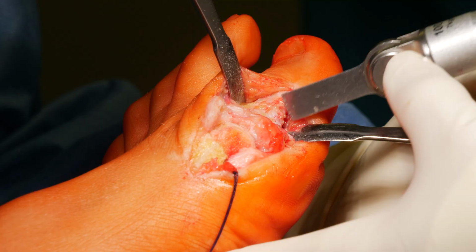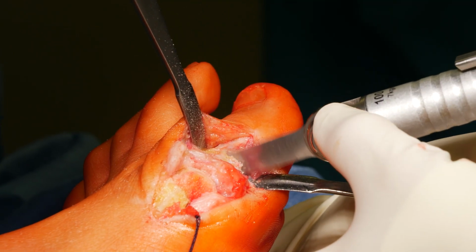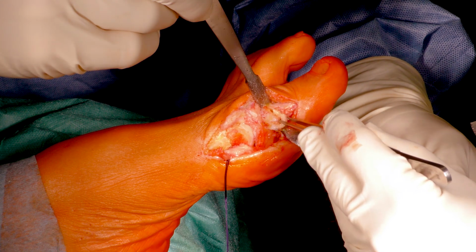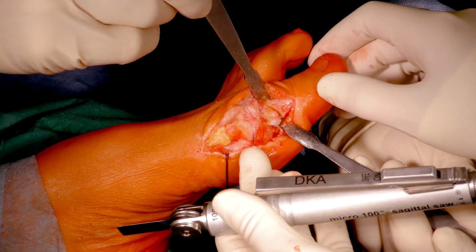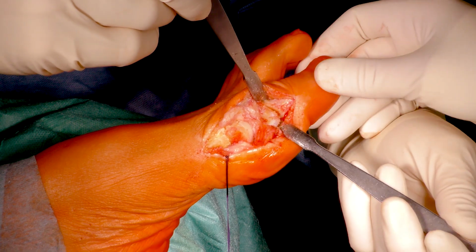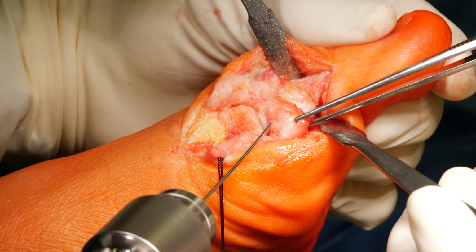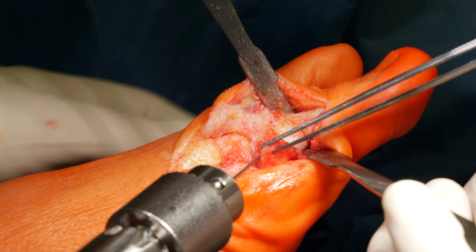Special care is taken for the flexor hallucis longus tendon, which runs in a bone channel with a retinaculum. The incomplete osteotomy is done in the proximal third of the phalanx, perpendicular to the corticalis, aiming proximal. A 2 mm cut is in most cases sufficient. The amount of correction is judged by intraoperative and radiological findings.